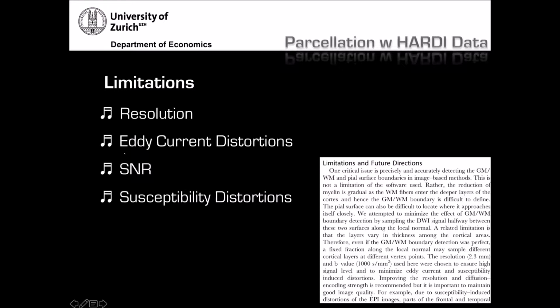For example, the diffusion signal over time, the undulation that you saw over the 60 or so diffusion directions, could simply be tissue being warped differently in each diffusion direction. Due to the eddy current distortions, you will have a very specific time signature, which is just a systematic bias. It has nothing to do with the underlying tissue. So somehow you want to get rid of these eddy currents.